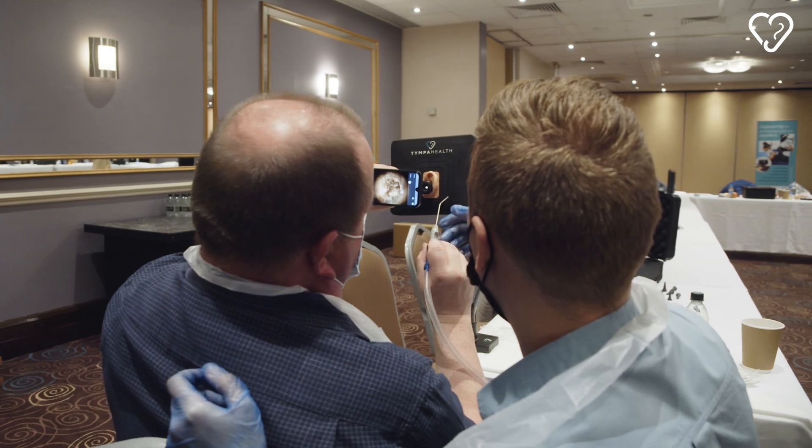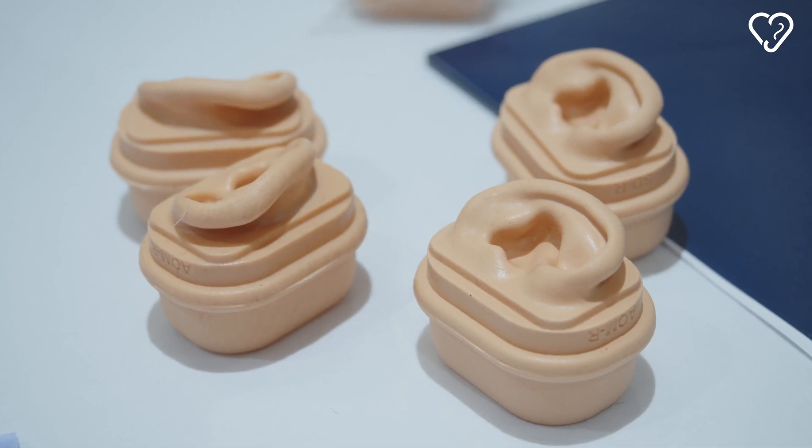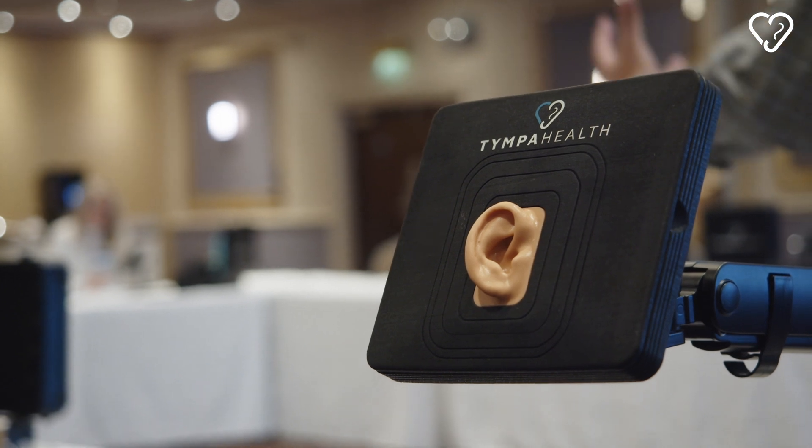My name is Dr. Krish Ramdu and I'm the founder and CEO here at TympaHealth. This is the TympaHealth simulation head. Everything about these simulation heads was designed so that you take the training environment and make it much easier to transition into when you see a real patient.